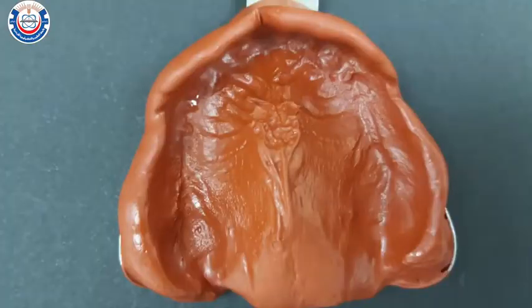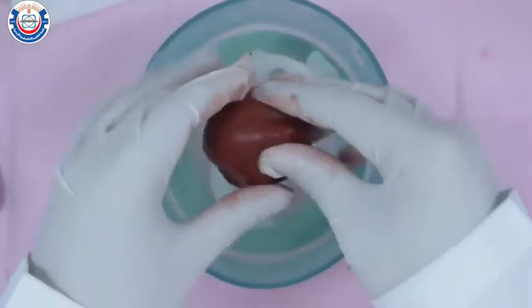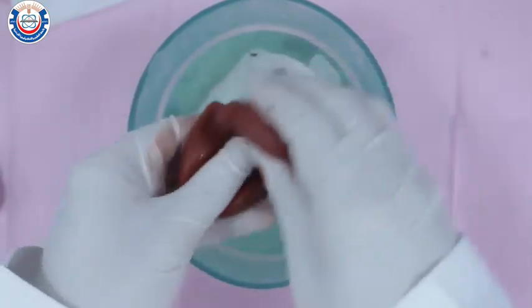To make the upper impression, follow the same procedures for manipulating the impression compound material. Once the material is completely softened, shape it into a bowl.